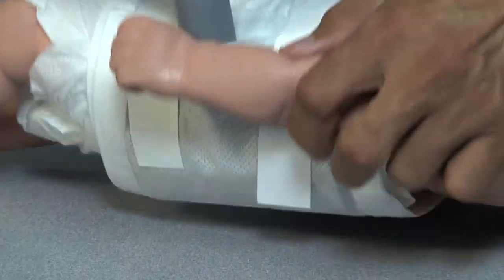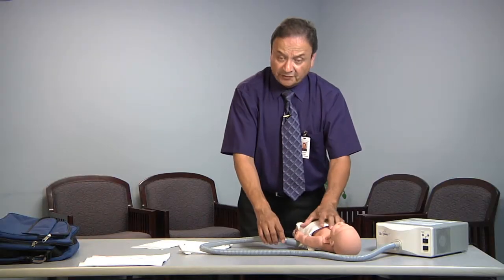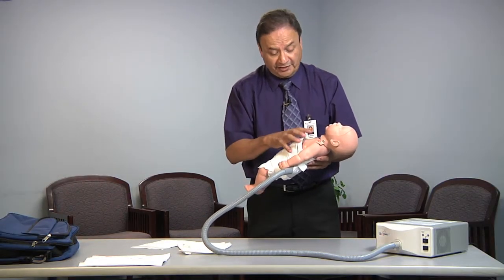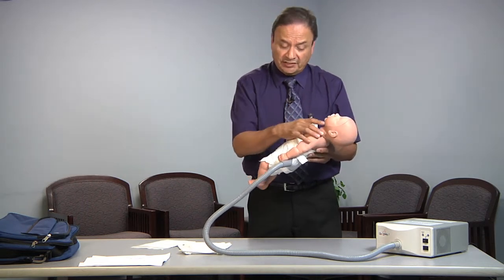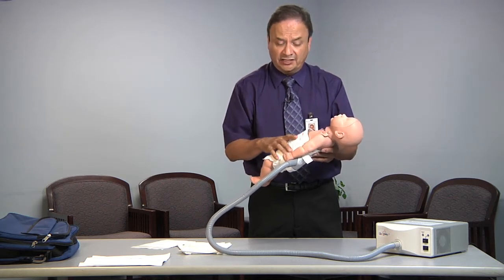And then, so it doesn't get uncomfortable for the baby, we're just going to slide it back down like this. It's a very loose fit, so don't worry if it doesn't fit right up with the baby. You're not going to wear any clothes. This is going to go against the baby's body. They'll still have the diaper on. Sometimes people put an oversized shirt on, or use a blanket to cover the baby.